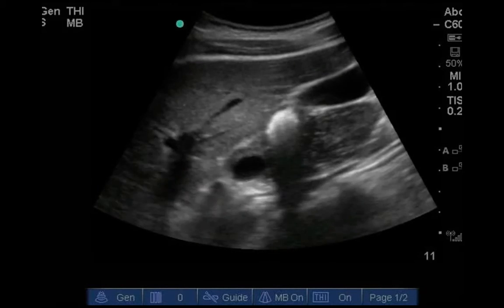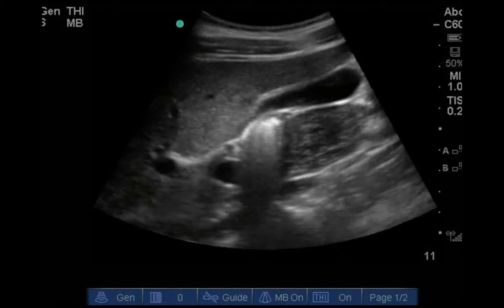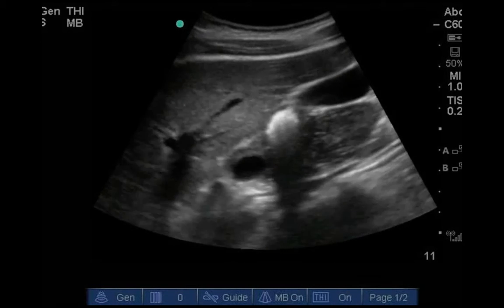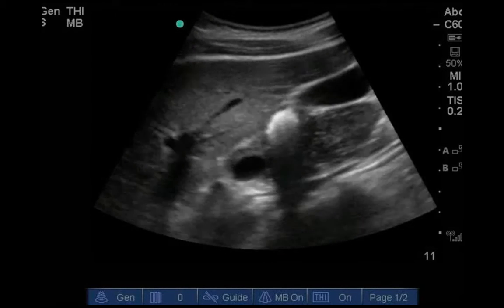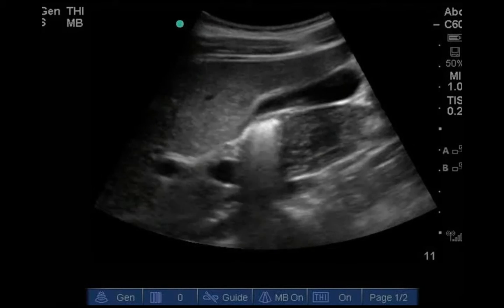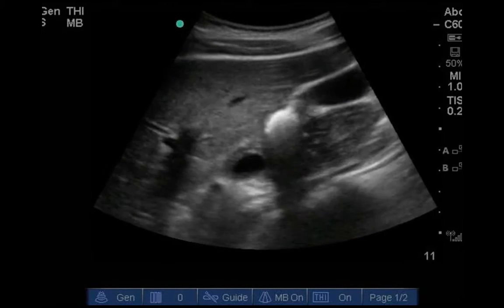The gallbladder wall is fibrous and typically acts as a bright reflector. Even in the setting of wall edema with cholecystitis, there are bright areas of wall between the areas of edema. However, the wall of the duodenum is dark, like most bowel wall. Additionally, the duodenum courses near the liver, but is never surrounded by it like the gallbladder. Also, observing the duodenum over time should reveal peristalsis, which will not occur with the gallbladder. And lastly, the gallbladder is finite, and clear boundaries can be visualized by scanning through from top to bottom and left to right. In contrast, the duodenum leads to the stomach proximally and the jejunum distally.